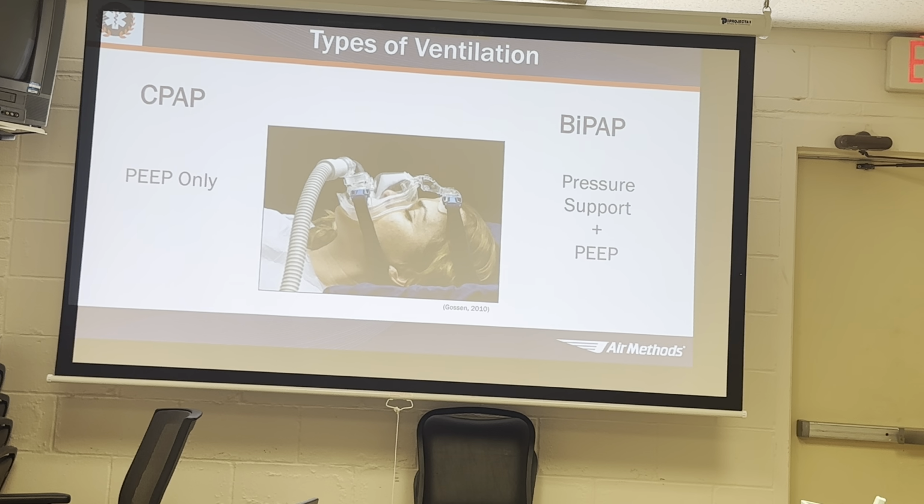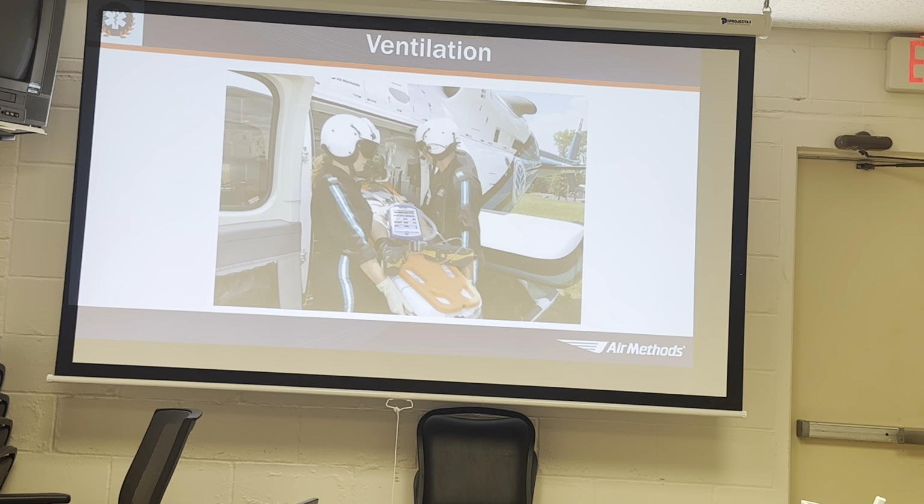I always love when we switch a patient over from a hospital ventilator to ours. There's a lot of settings that you can dial in on BiPAP that we won't go into in this, but it always is an adjustment for them to move over to a different ventilator. So when you put a patient on BiPAP, getting them to chill is key. Maybe some Ativan or Versed will help that.